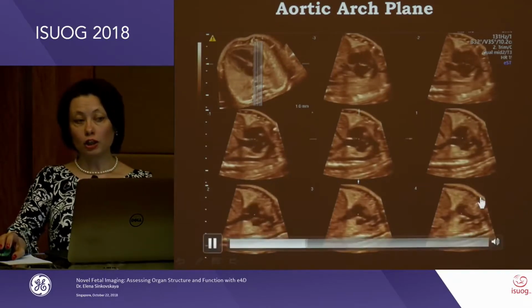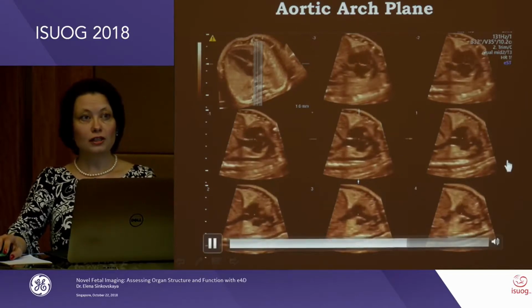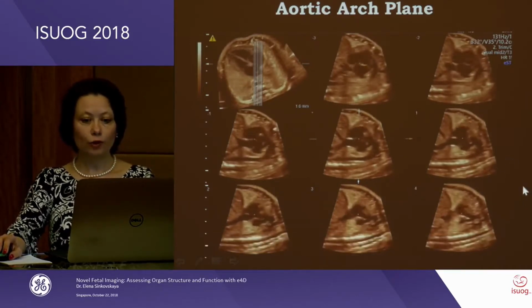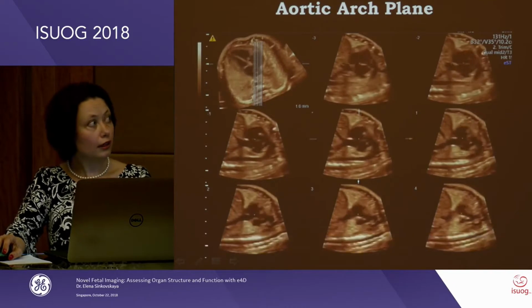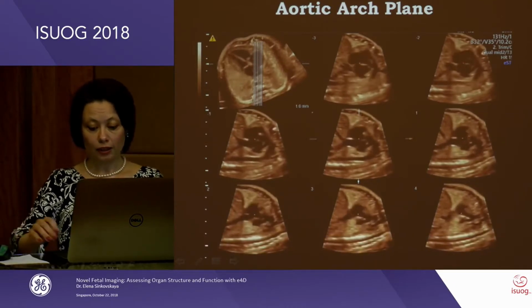So obtaining a good quality volume allows you to retrieve all those images in seconds and confirm that the heart is normal, and not only in the screening settings, but pretty much this is the complete fetal echocardiogram.